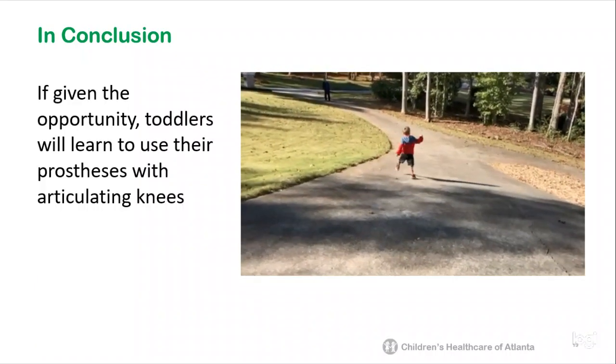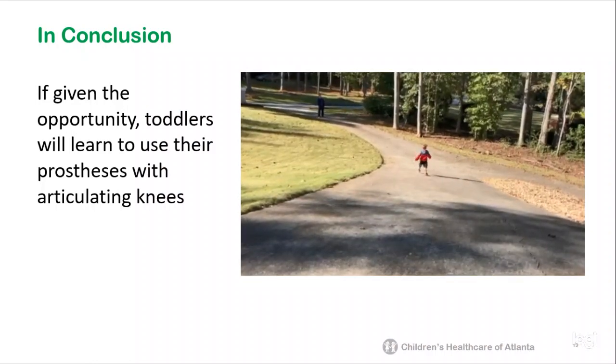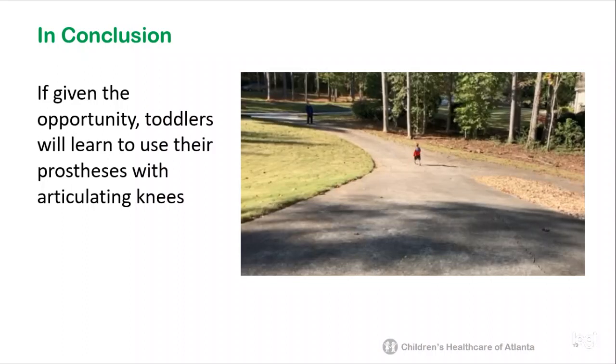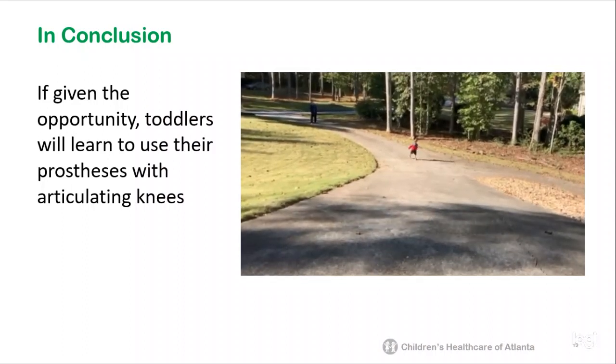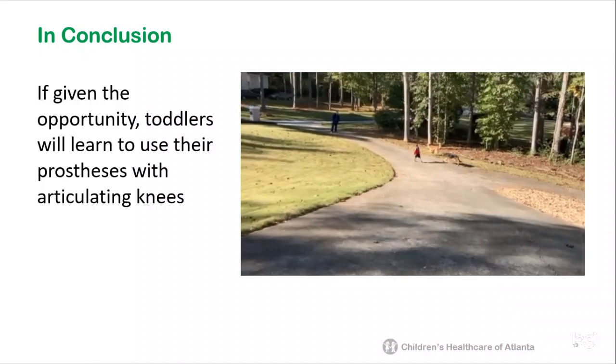In conclusion, it's the experience of this center that if the child is given the opportunity, has good support from their family and healthcare team, they will quickly learn to use their prostheses with articulating knees safely and effectively.